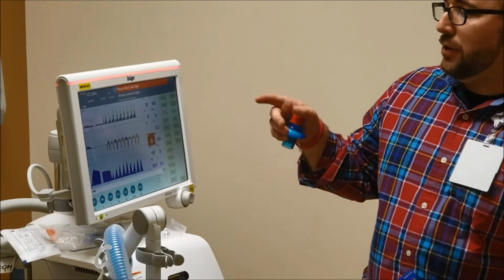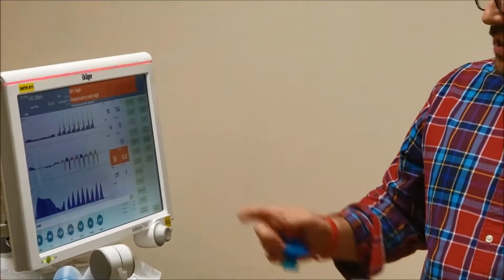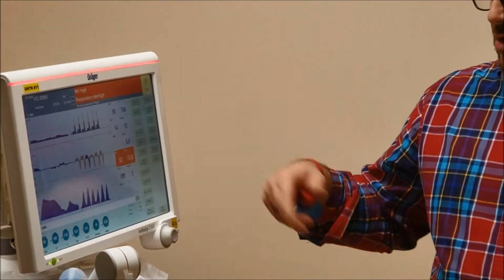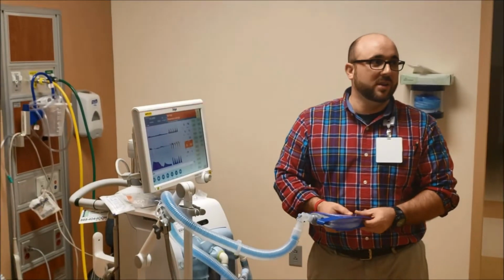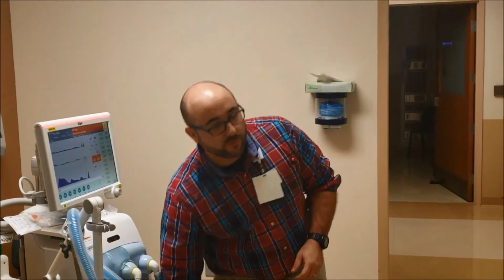So, how do you fix your patient that's coughing? First thing you do is you silence this thing because you're standing next to them. That's really annoying, and you can't think. Calling respiratory is a good thing to do, but the main reason they're coughing is they're waking up or secretions, so they might need suction. So you guys do inline suction down here.